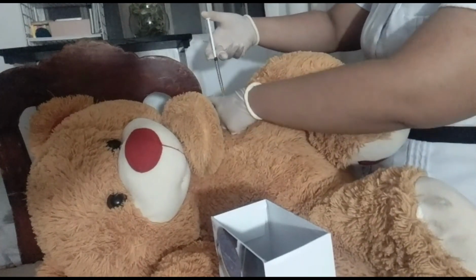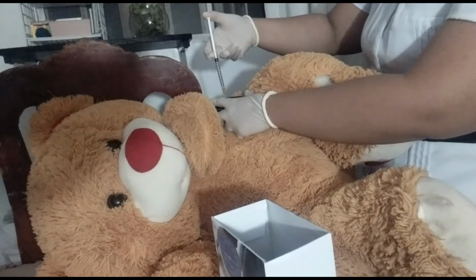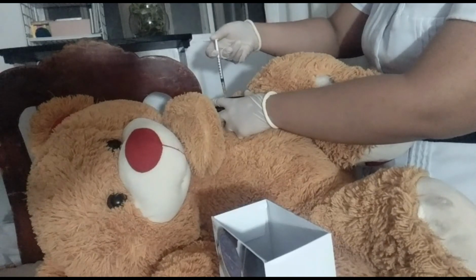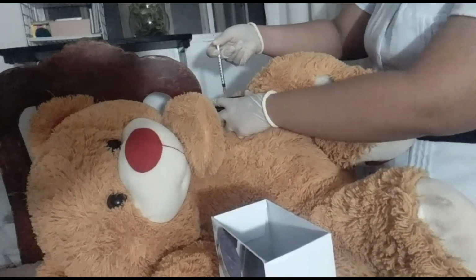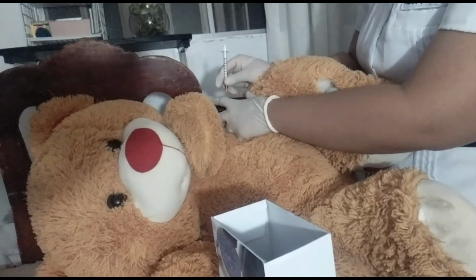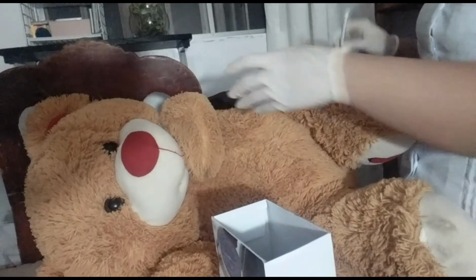After that, I will now inject the medication. After the injection, wait 10 seconds. I will now withdraw the needle smoothly at the same angle of insertion.